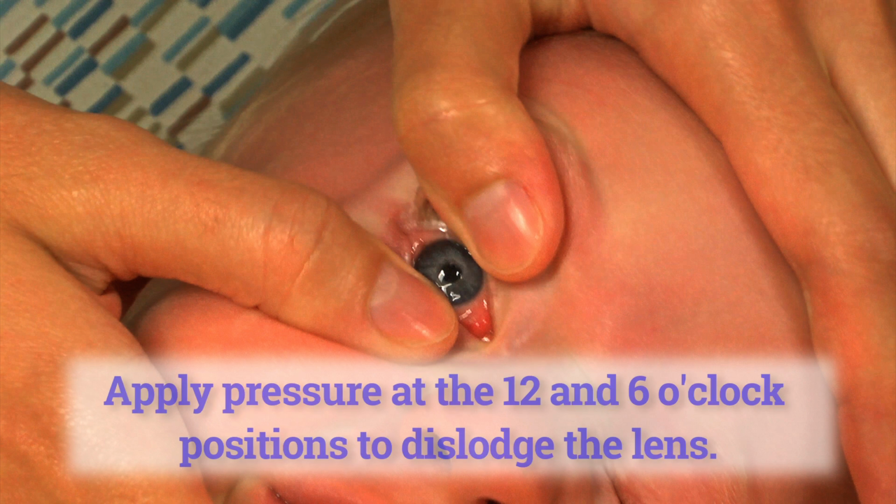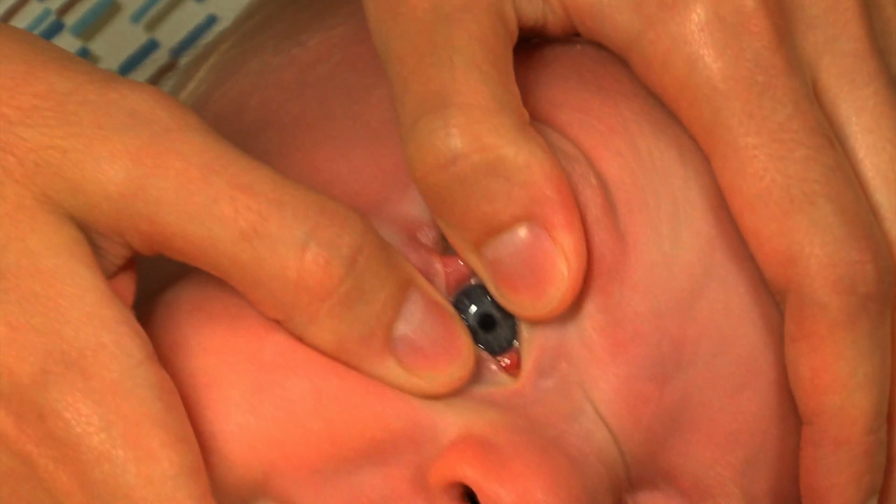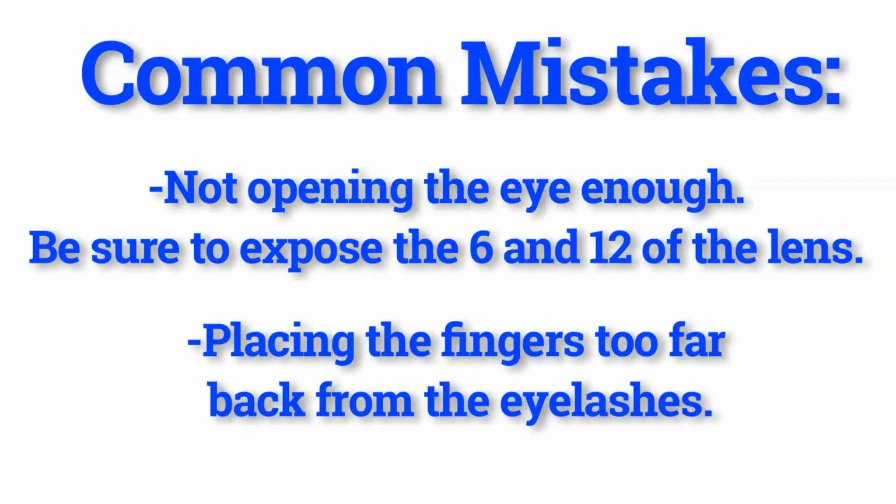Once you have both eyelids pulled away, gently apply pressure at the 12 and 6 o'clock positions to dislodge the contact lens. Common mistakes when removing a contact lens include not pulling the eyelids far enough apart before you apply pressure to remove the lens. You should be sure to expose the 6 and 12 of the lens first, and placing your fingers too far back from the eyelashes, which causes the eyelids to turn inside out.